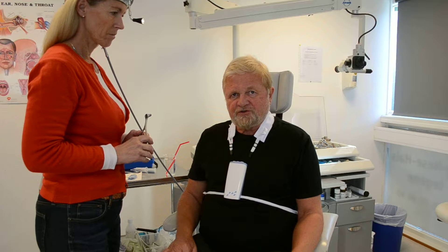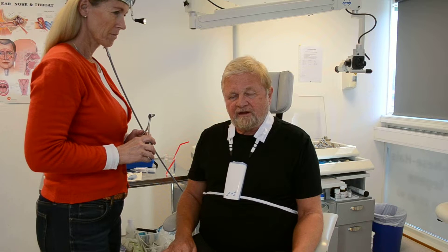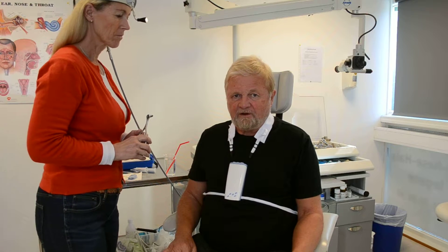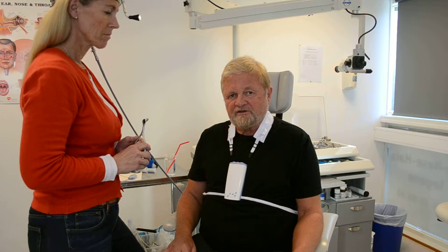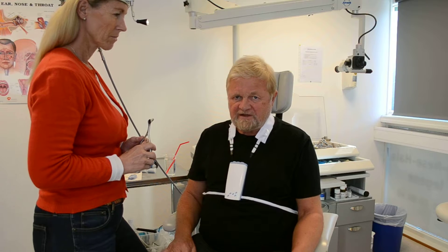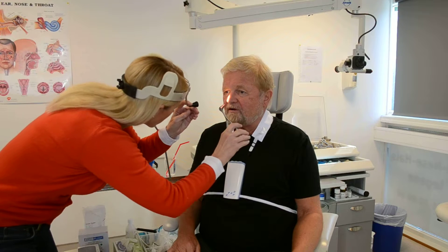This is to show the insertion of the catheter when you are going to have a whole night recording with the ApneaGraph spiral sleep diagnostic system for obstructive sleep apnea syndrome. Firstly, you have to overview the nostrils and nasal cavities to see which is the most open.